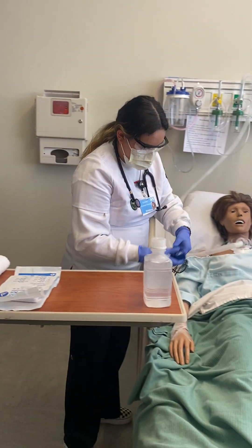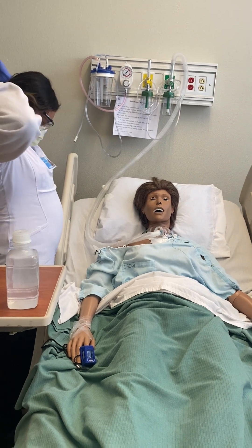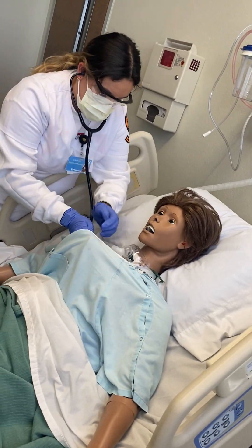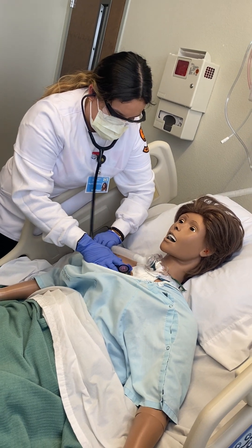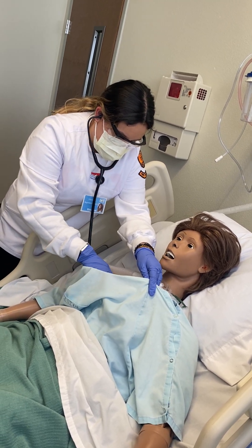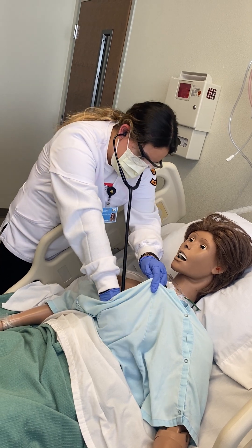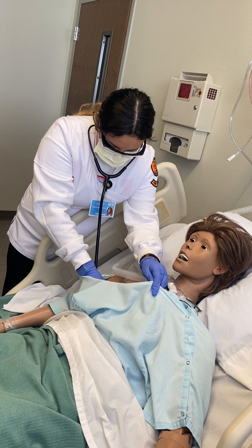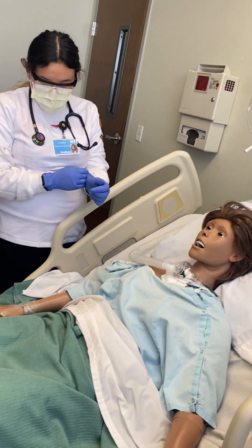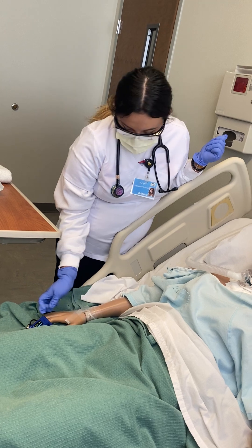All righty. I'm going to go ahead and set this over here and let it read out your oxygen. While it's reading your oxygen, I'm going to take a look and listen to your lung sounds. So I am hearing some little bit of mucus and congestion, so I'm going to go ahead and perform some suctioning, and I confirmed that with your O2 — you're sitting at a 93. So I'm just going to go ahead and perform that, okay? Okay.